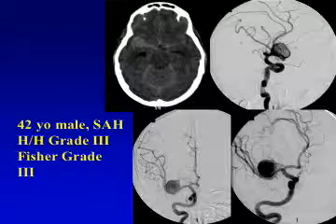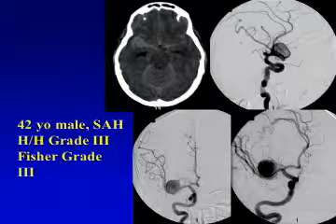In fact, we started a decade ago a division of surgical navigation in neurosurgery, and I think we've used every single navigation system that's ever been on the market at Stanford one time or another, and we've invented some. So let me see here. This is a throwback to what we used to do, and we moved from the era of using angiography in really two planes to this, about a decade ago, and this was our primitive CTA, which by today's standards seems unimaginable that we could be working with this.